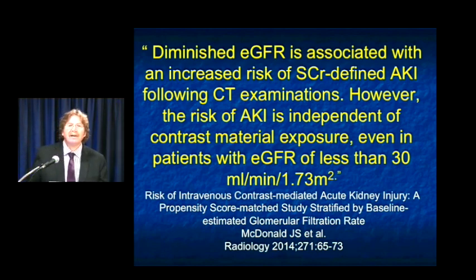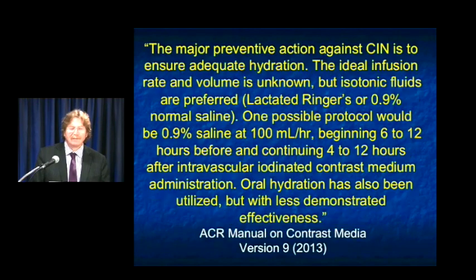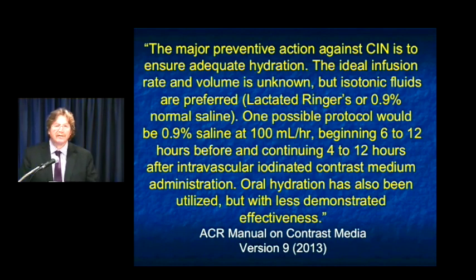However, it's an independent factor even in patients with GFR less than 30. Lots of interest in figuring out ways perhaps of having more patients be able to get contrast because I think we overestimated the risk.